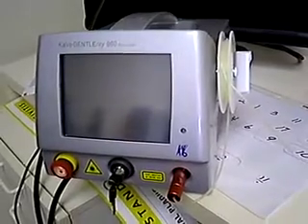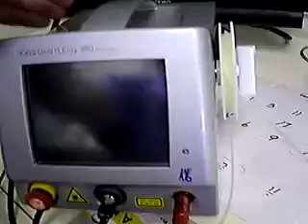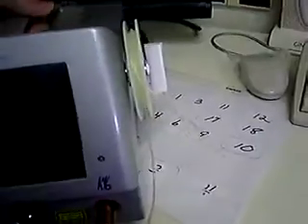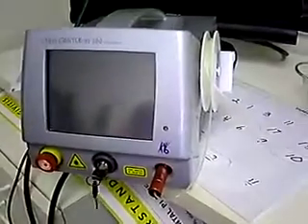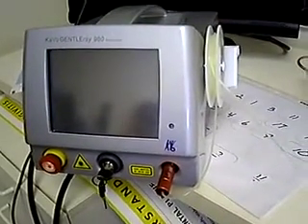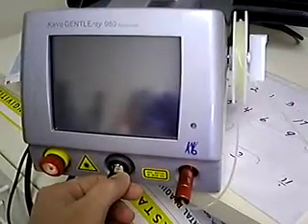Here is the Kavo 980 laser, the Gentleray. It's a pretty compact unit — not very heavy, simple to carry in one hand. It has this white piece here, which means you can take the fiber spool and place it on either side of the unit. It does have a corded foot pedal, and it's not difficult to move around.